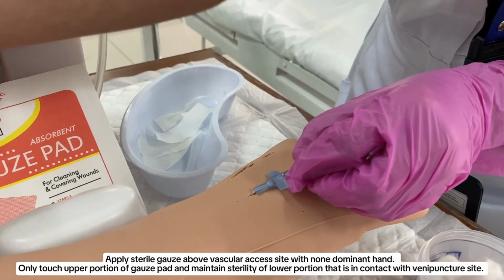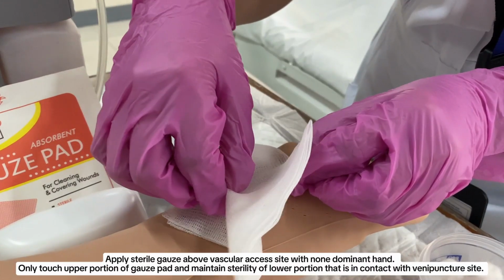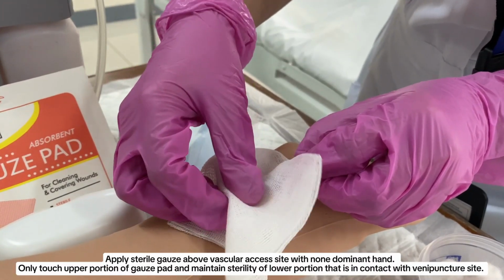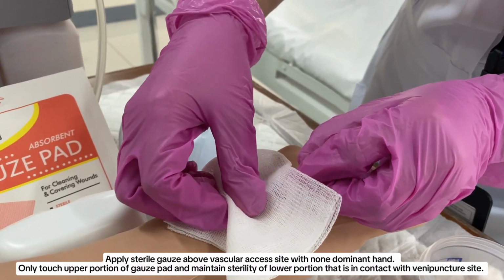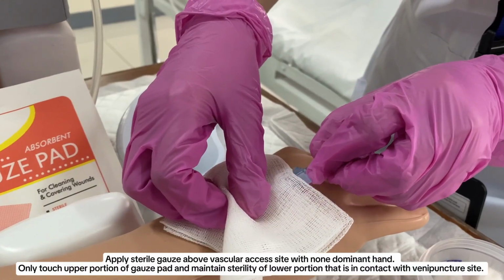Apply sterile gauze above the vascular access site with a non-dominant hand. Only touch the upper portion of the gauze pad and maintain sterility of the lower portion that is in contact with the venipuncture site.